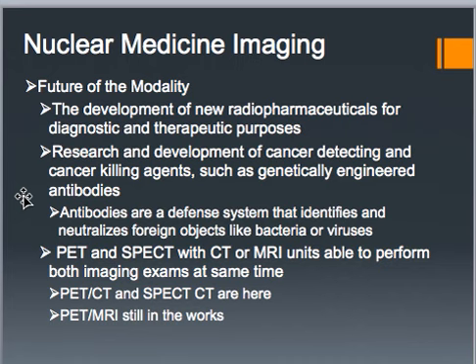They're using PET and SPECT with CT and MRI, kind of fusion images. Well, this says PET and MRI still in the works, but it's actually here. And I'll show you some of those images in just a little bit. So I'll stop this one right here, and then I'll come back and do the image one separately. It's short, so it won't be that long.